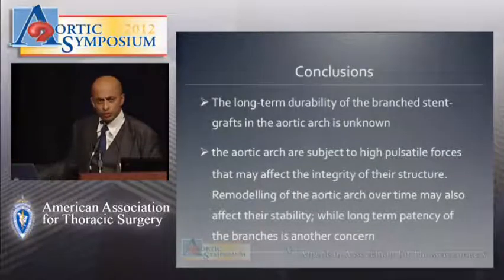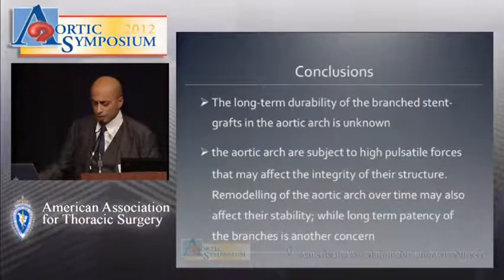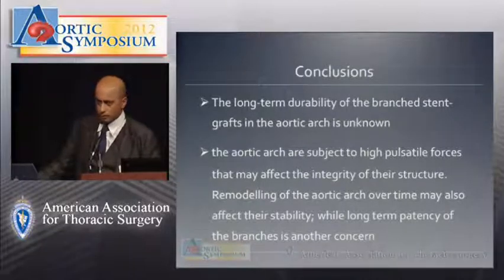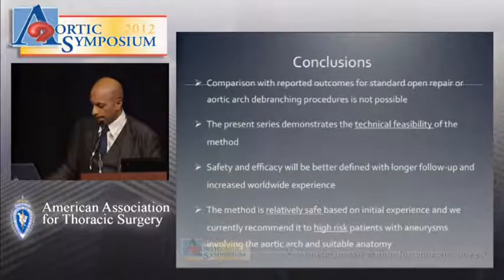So in conclusion, we don't know the long-term durability, and I can tell you that we're now 18 to 24 months out with a couple of these patients, and they've done fine. My gut feeling is that if you get past the 30-day mark, they're going to be much like some of our fenestrated and branch graft experiences. They do fine long-term. It's really going to be choosing the right patients to get the right technical result that is going to be the determining factor.